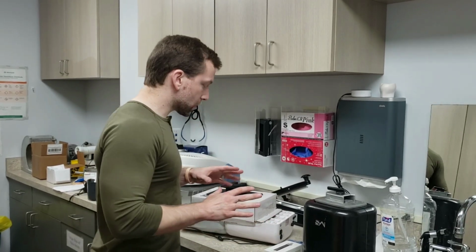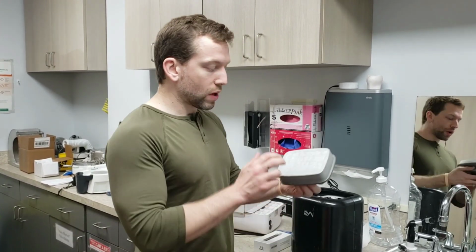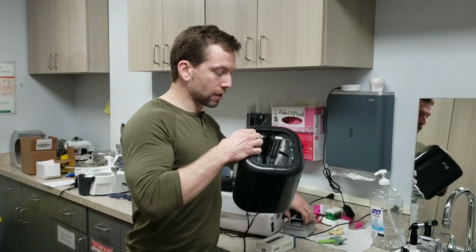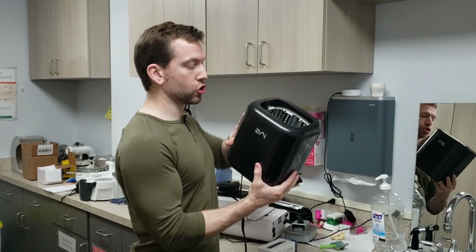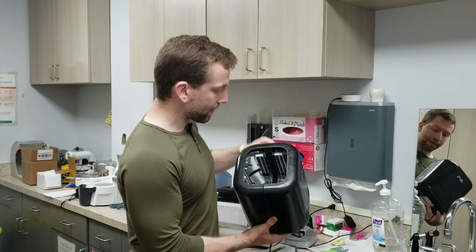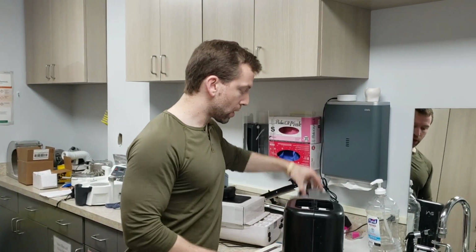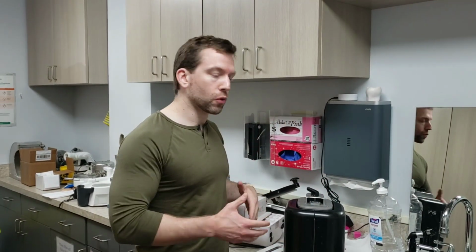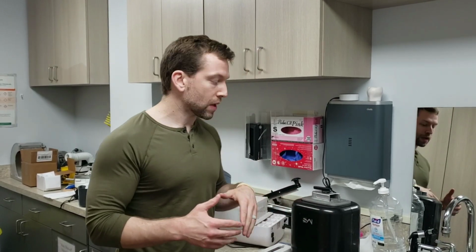Okay, so how this works is, I've shown in previous videos how for the Moonray print bed, we take two of these nail curing lamps, and we quite literally just tape them together. So there's two separate units. Each one's like $25. Now, I did have to grind two areas here and here so that the print bed slides right in there and nestles in there. So if you've watched my videos before, you may have seen that. And so that's worked great over the years, okay?